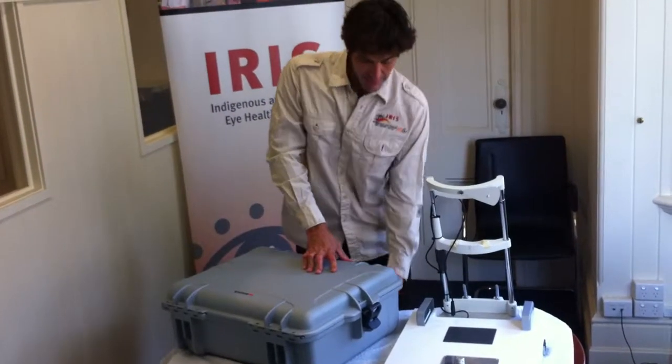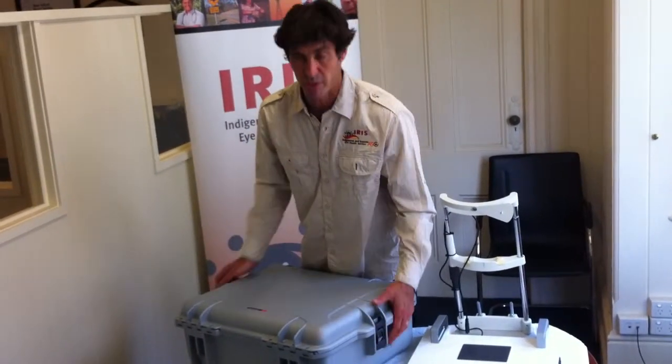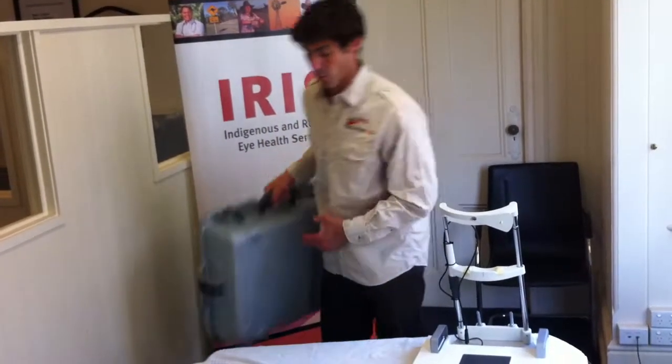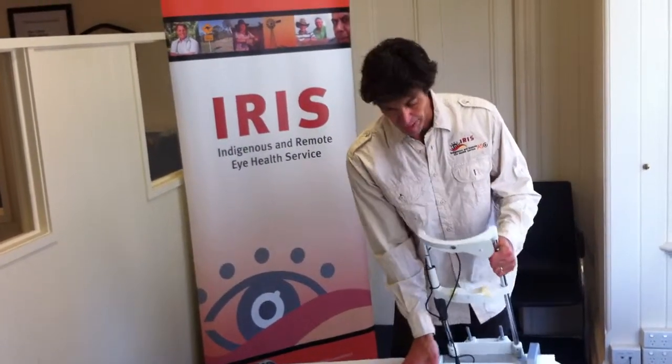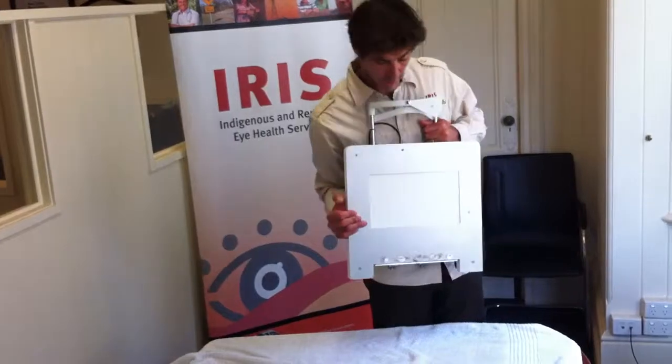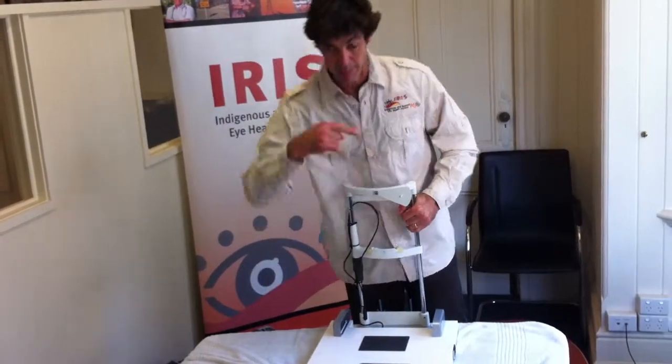What you're going to need is a table. We've put a towel down here today because it's a nice shiny wooden table, but on a laminate table you wouldn't worry about that. The idea is this clamps to the table — it's got its own power source within it — and the slit lamp itself just plugs straight onto here, as I'll show you in just a moment.